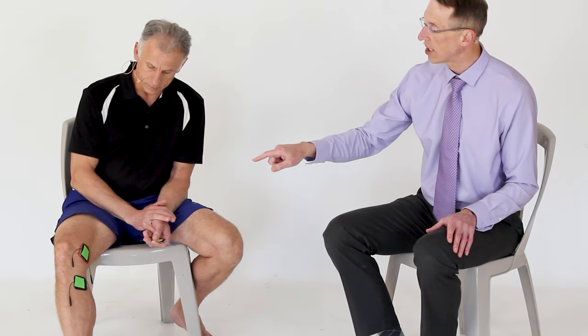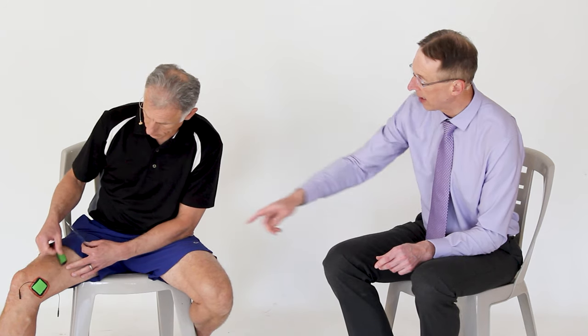Now, a second choice would be to take the other pad and put it above the medial pad right there. Another choice, we'll just keep going, because these are all available on the PDF that comes along with this program. It'll have pictures of all these. You can print it off. You can put one above the pain and one below the pain. So you can take that one off the medial.